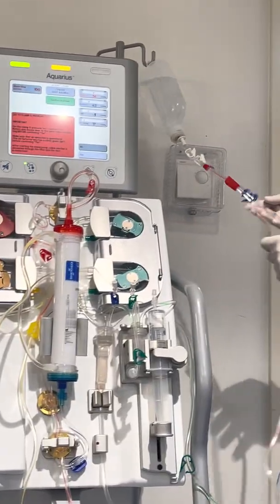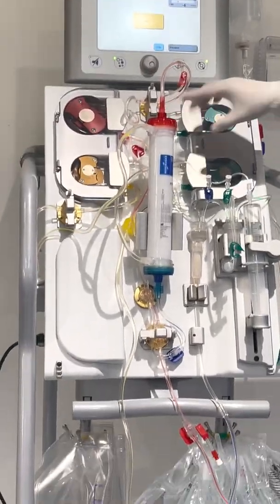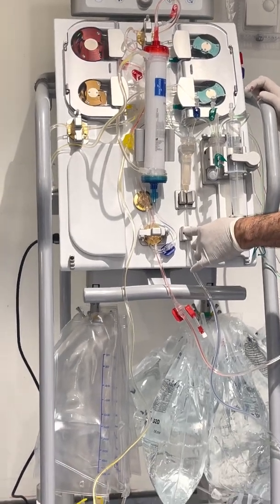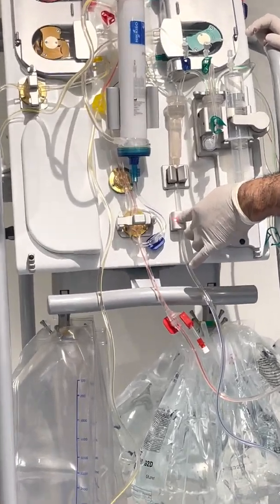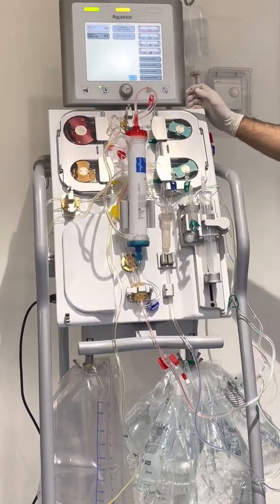So this one, no need to close. Just leave it like this. Then press yes. So the machine will run. Then it will occlude the clamp here. See, it clamped already. Then the pressure will increase. So now it passed. That's it. Very easy.